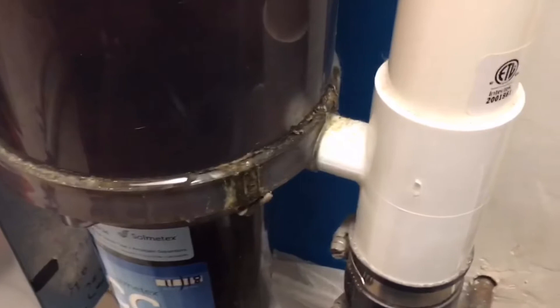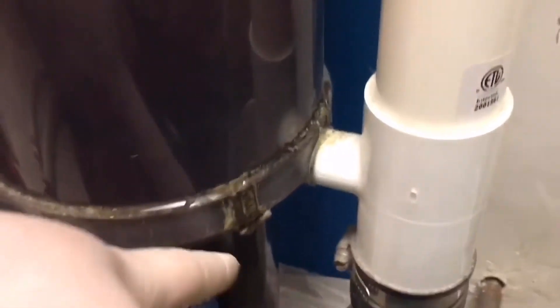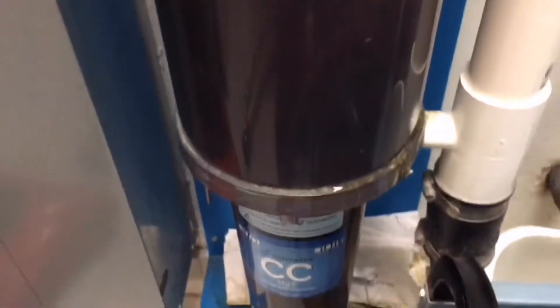Aside from the 50% savings on the amalgam separator costs, this 8-chair practice is upgrading to a Liberty Boss because the upper chamber and lower chamber of the HG5 has separated, causing a leak.